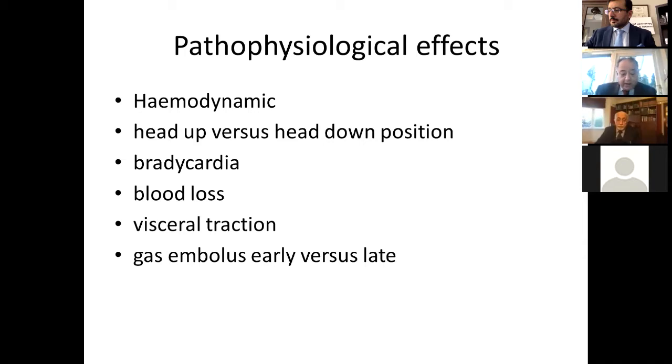So you need a fully alert anesthetist with monitoring of the usual ECG, blood pressure, saturation, carbon dioxide, because you have to stop surgery momentarily until this is corrected. It does happen, and if it passes unnoticed, it can cause very severe problems to the recovery of this patient.